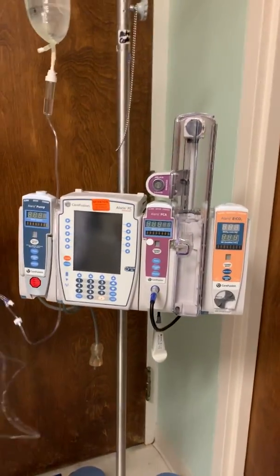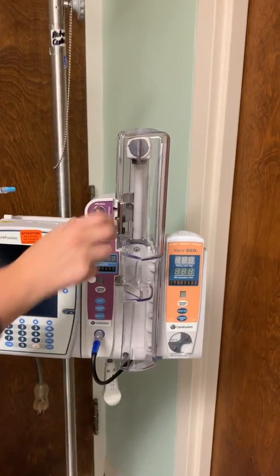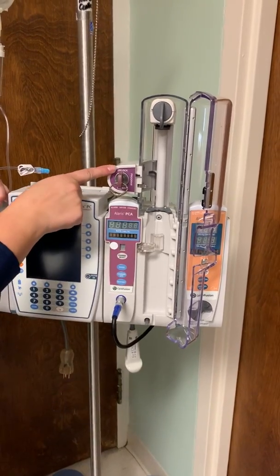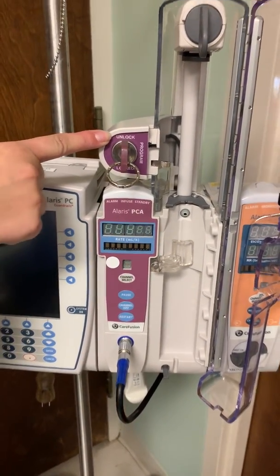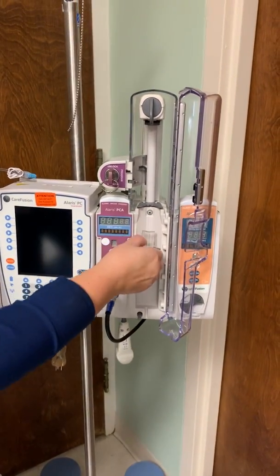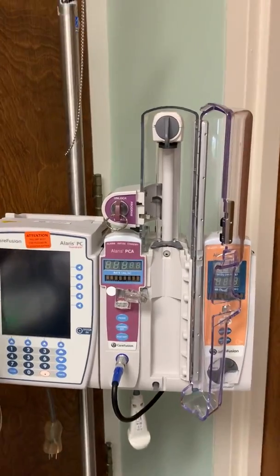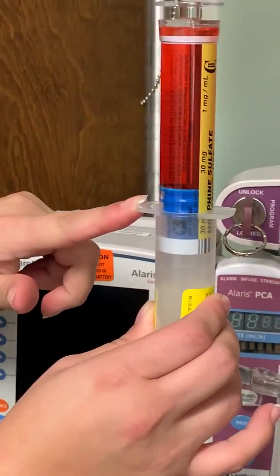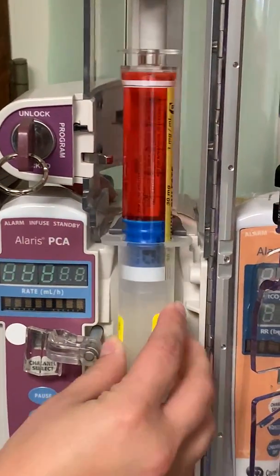Use the PCA pump key that comes from Omnicell to open the syringe barrel. And you have to turn to the unlocked position, which looks like the locked position, so that is a little confusing. Now you're going to insert the syringe. Big importance here. You have to put the flat edges of the barrel under the gray piece with the screws. So we're going to zoom in on that so you can see that.